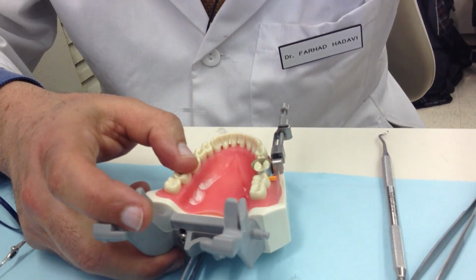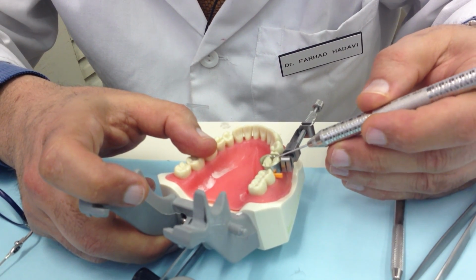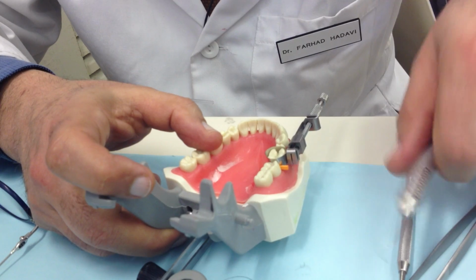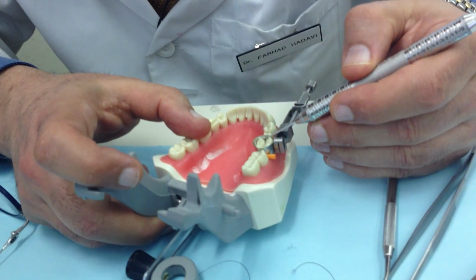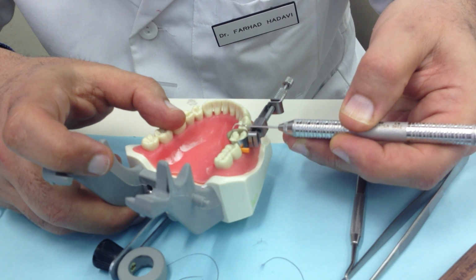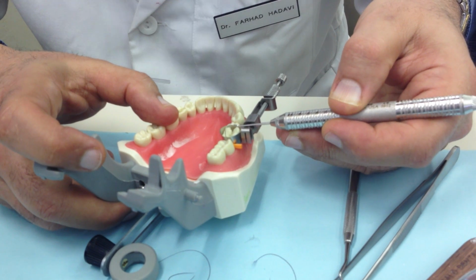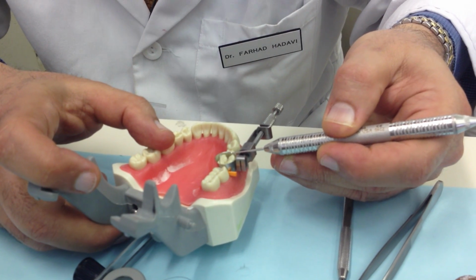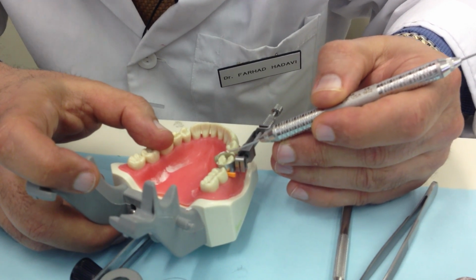Now, when I place amalgam restoration, the marginal ridge of this amalgam should be exactly the same as the marginal ridge on this side, correct? As I'm condensing over here and my amalgam comes over here, I keep looking at this marginal ridge and over here, and sometimes I measure it. And then I bring that one right over here. Can you see that one? I measure it to be sure that I remove enough amalgam so I establish my marginal ridge in amalgam exactly at the same level as this one. I just pick on it and see how it is. I remove it enough until I am at that level.